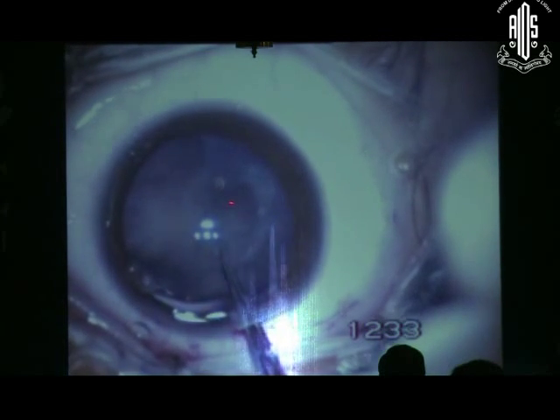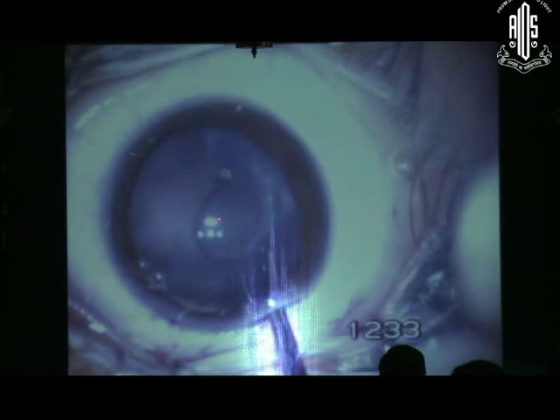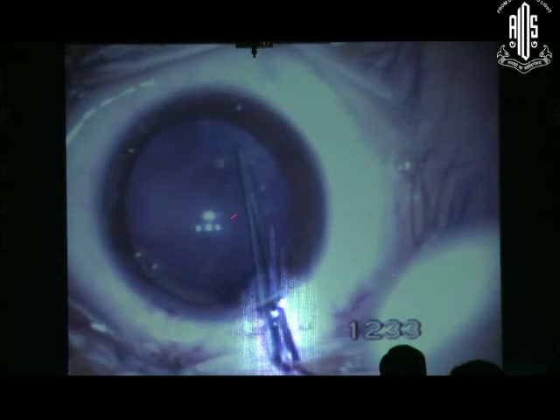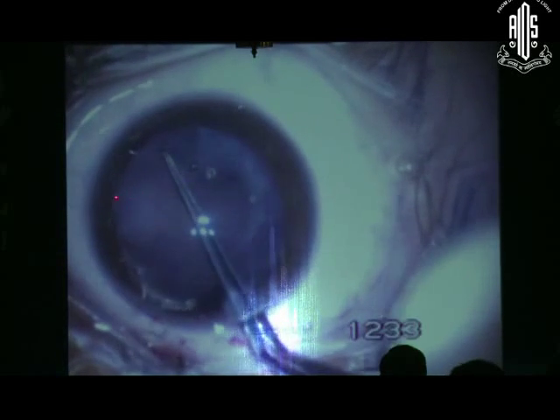The child was below 1 year of age, so we just do a slight core anterior vitrectomy because it was eccentric. So the capsular rhexis has been extended. You can see that the capsular rhexis has been extended. Now, unfortunately, you need to be very careful at that particular point.